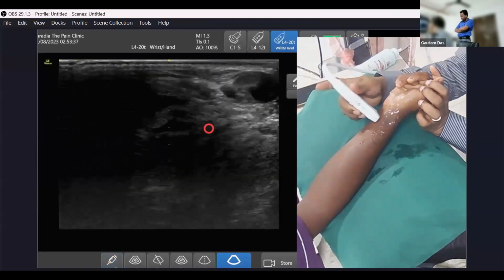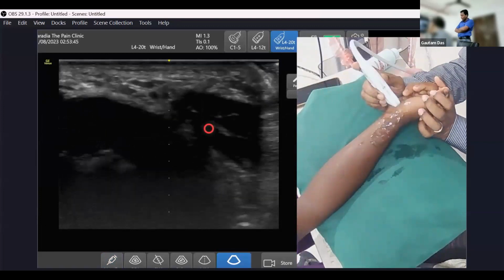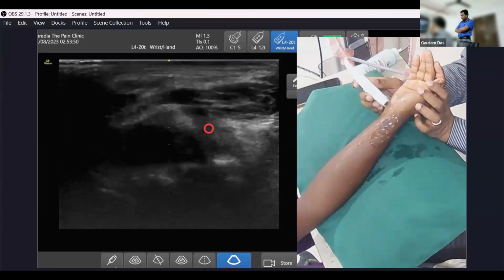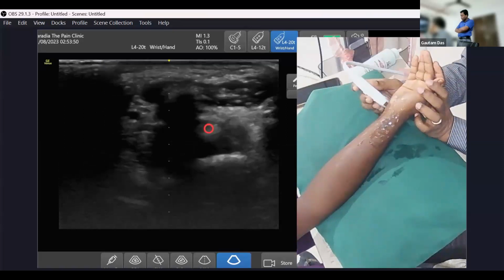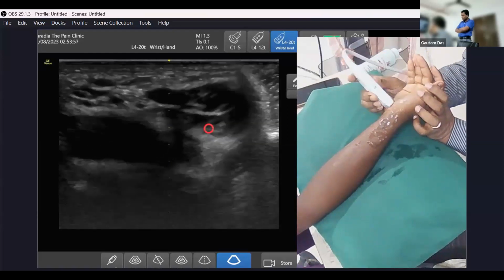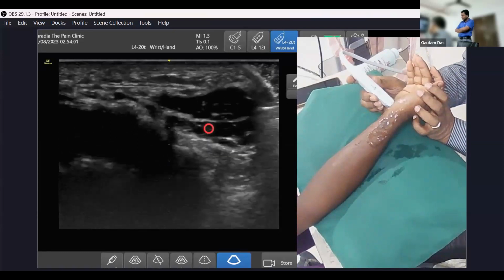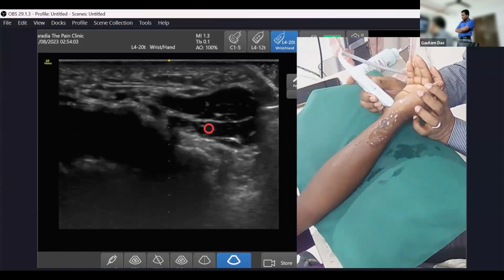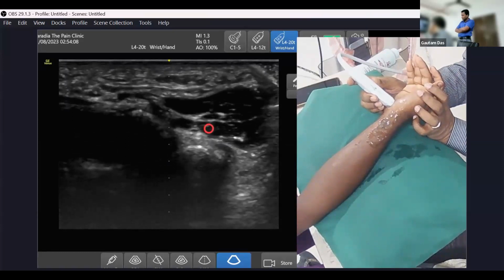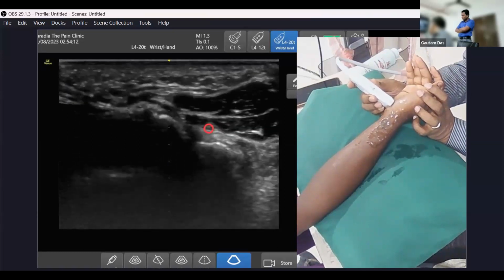So if I am holding it here, while the ulnar artery was seen in the distal part of the carpal tunnel, if I am going on the lateral side, then I will be able to see the whole of the hamate, including base and the hook. So this was your base and the hook of the hamate, and here if I am going there, this was the ulnar artery, ulnar nerve, while it is getting divided. You can see the artery is getting divided. It was 1, and now it is getting 2, and also the nerve, you see 1 and getting 2. Superficial and deep. So this was your hook of the hamate, and base of the hamate.